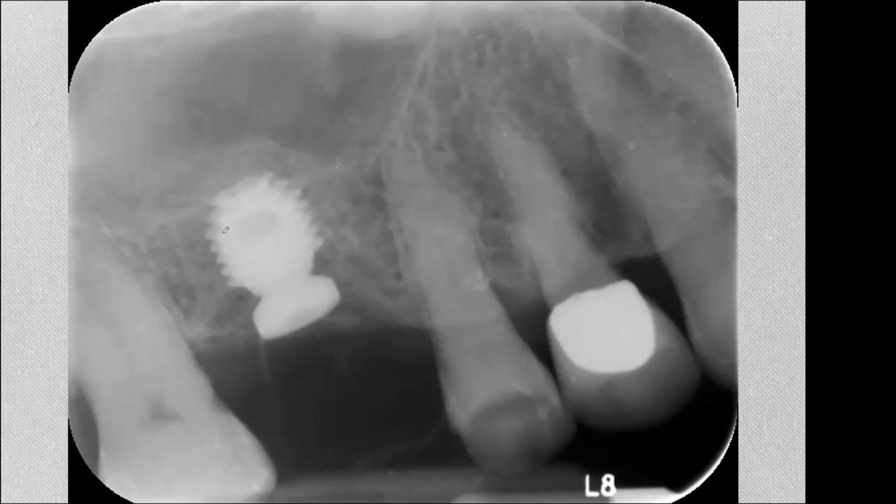You cannot even tell. And that's one of the advantages of the SynthoGraft, it is incorporated so quickly and so completely and resorbed that it becomes trabecular, almost like the native bone, and quickly at that. Okay. And so I just wanted for you to see that example, that difference.